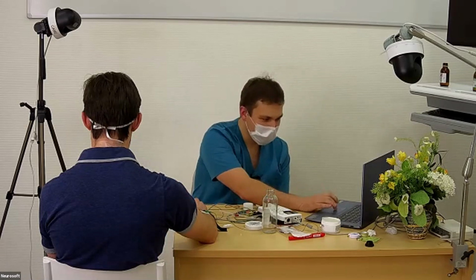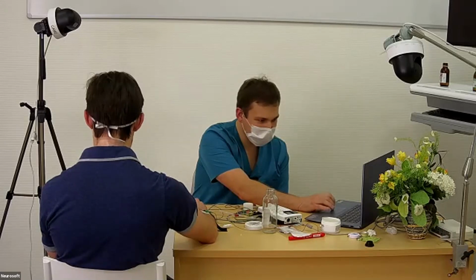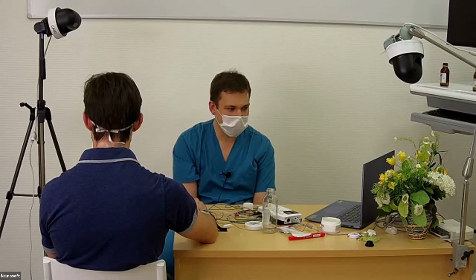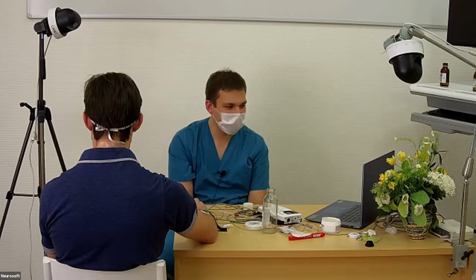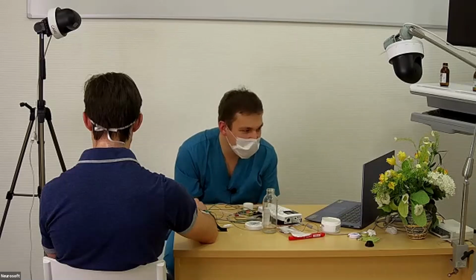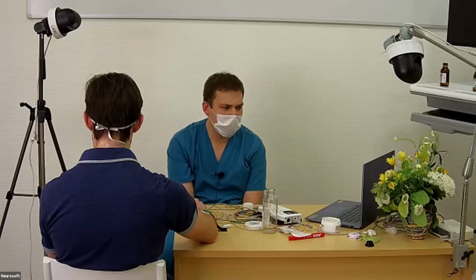From Carlos: is it always with contraction in the fingers, with the electrical stimulation at the wrist? I think it is a question about the cutaneous silent period. Yes, because this question was asked during this technique.